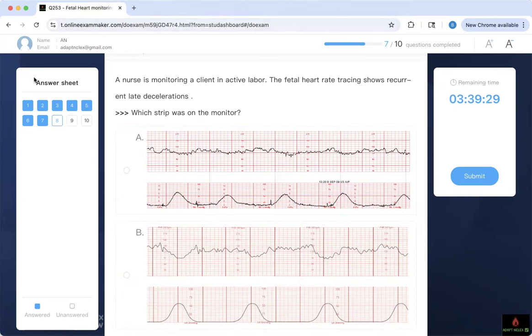This is the 10 minutes, right? I count 1, 2, 3, 4, 5. That's good. What is the baby heart rate doing? When I trace like that, nothing is coming down. You see what I'm doing? Nothing is coming. This is normal. I'm done. Then I go to the next one.